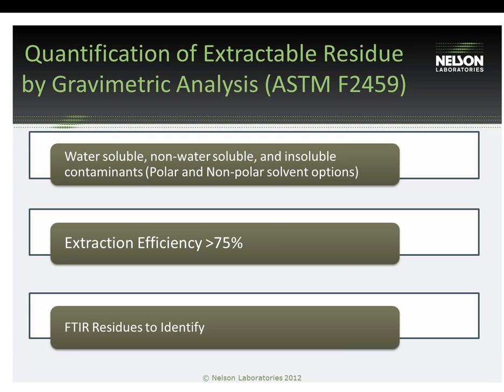And so we take the device and submerge it in water. We do a sonication step, which is a very vigorous shaking to shake off those surface residues.